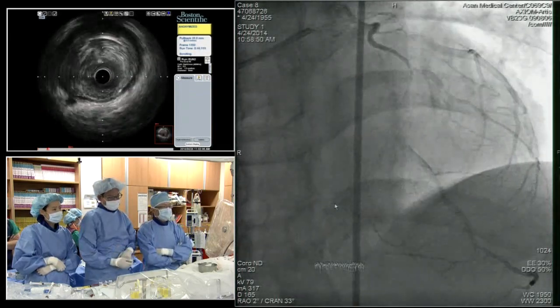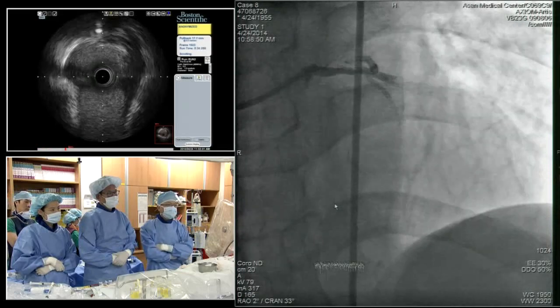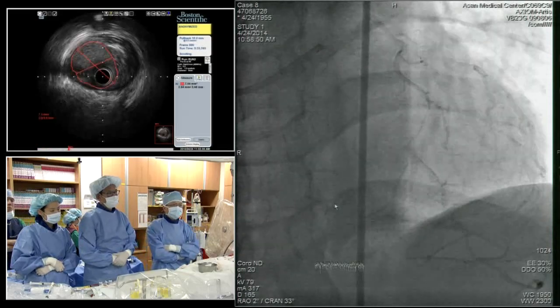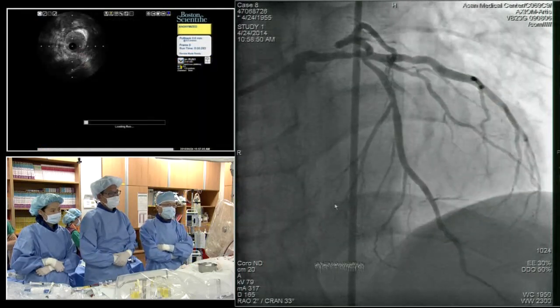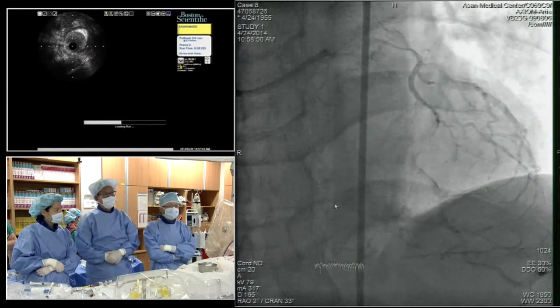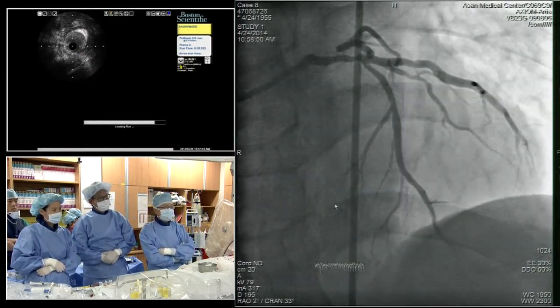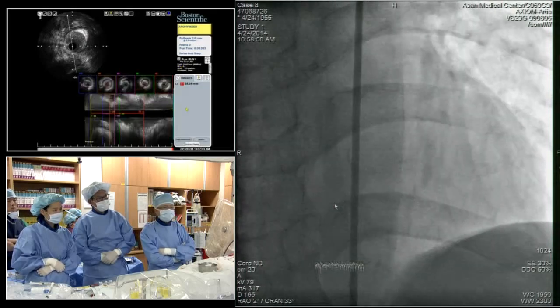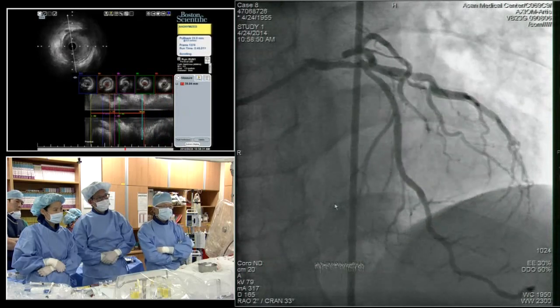So obviously the left main needs to be covered from maybe one third into the left main. And then I think as the ultrasound shows, the ostium of the LAD is quite involved, and maybe all the way down to the first septal or so. But there is enough of an area in between, you can probably land there, that can get a pretty good lumen area, but you will leave a fair amount of plaque behind, obviously not covered, which is okay.